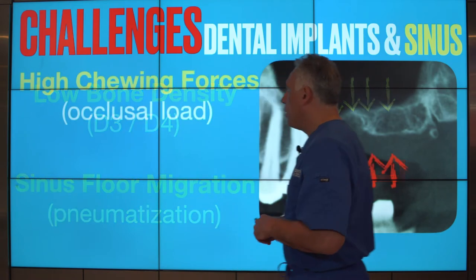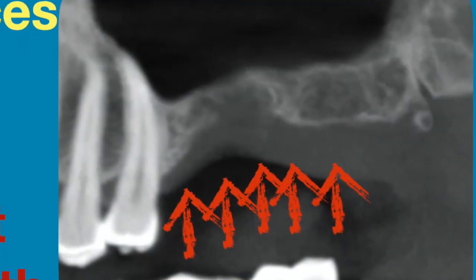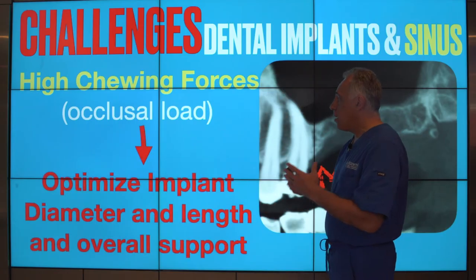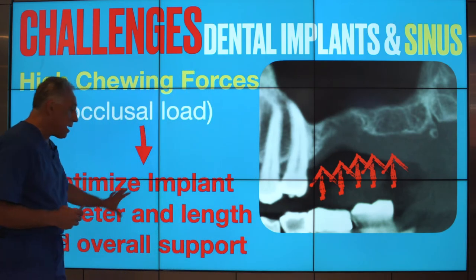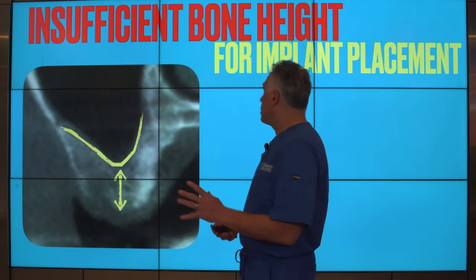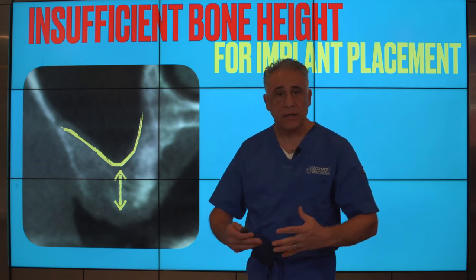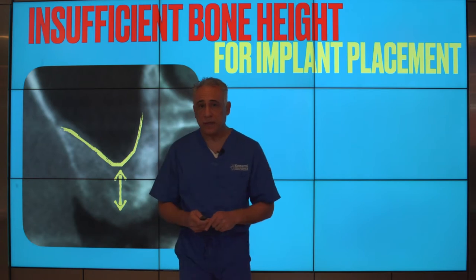On top of that, we have high chewing forces in the back area of the jawbone, very high occlusal forces. So we have to consider our treatments in a way that we can optimize the implant diameter and length and improve the overall support, because we do have these challenges to face. So when we have insufficient bone height for implant placement, we must consider a technique to augment the vertical height of bone sufficient for support of the dental implant.